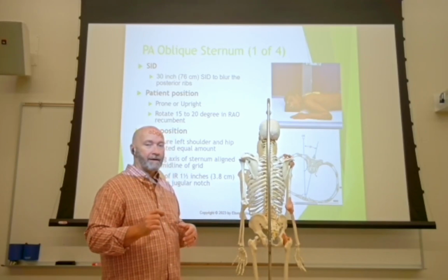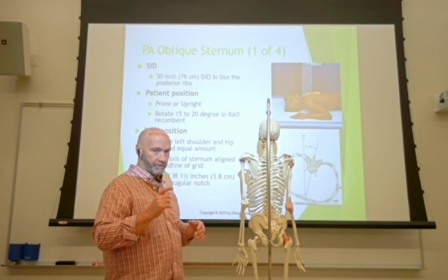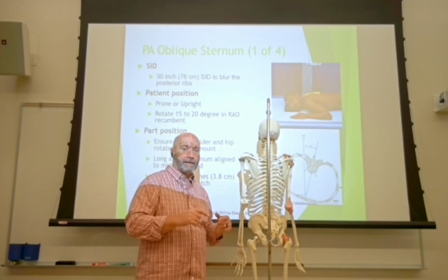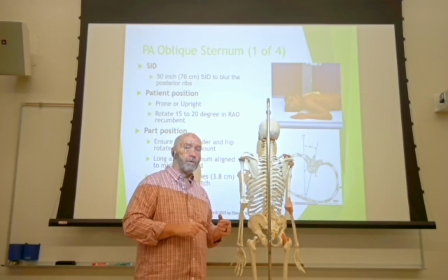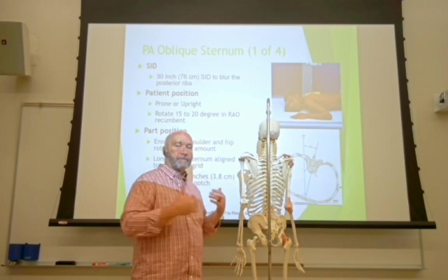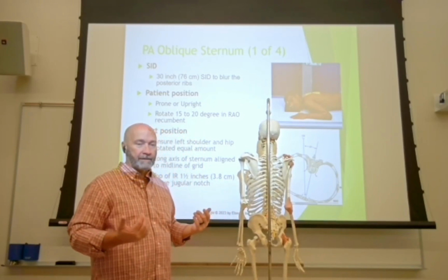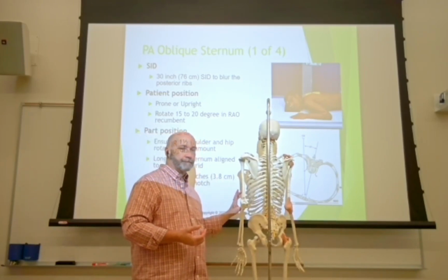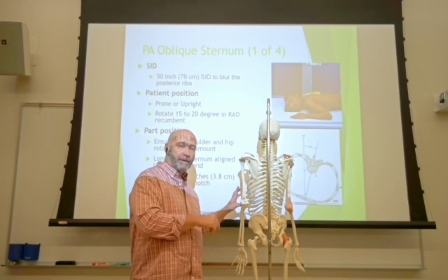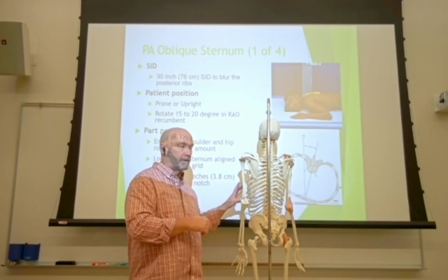So what you might have to do in order to accomplish a breathing technique, if you're phototiming, is override the MA. So drop the MA as low as it will go. Still activate that center cell. So you may have to just completely go without the presets. You may have to set the center cell, and you might have to manually lower your MA to as low as it will possibly go.